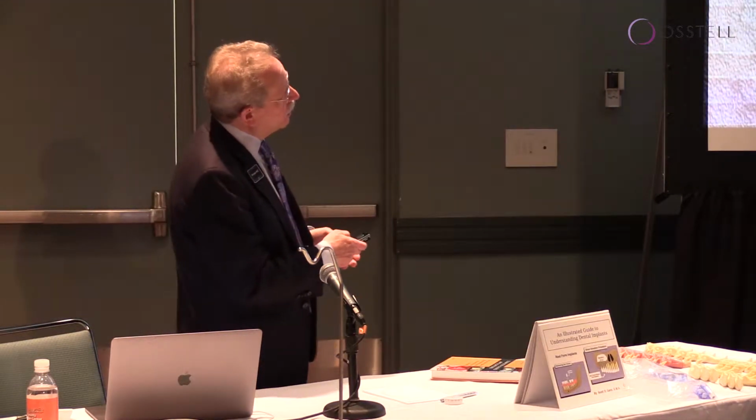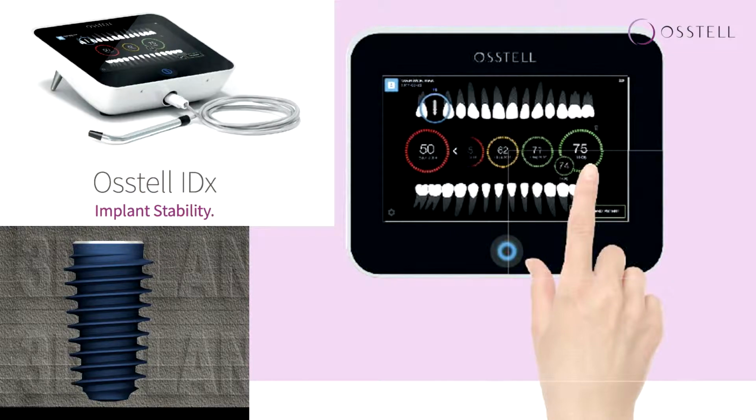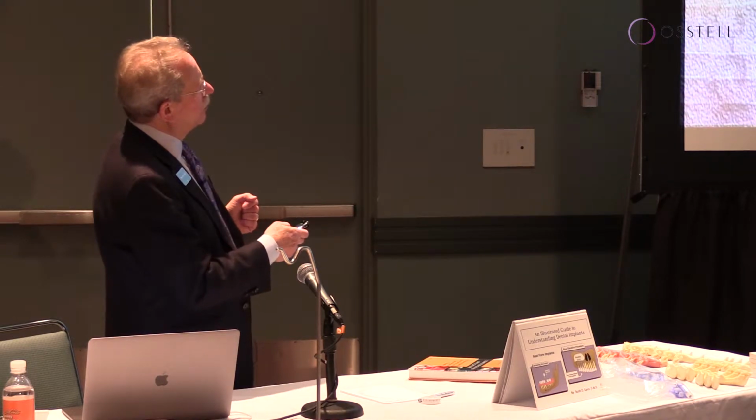So when we're looking here, you can see that your assistant or yourself, whoever's doing this, you can go in, you can click on a tooth. You can actually input a tremendous amount of data about the manufacturer of the implant, the diameter and the length of the implant. The only thing that's still in common is the probe.